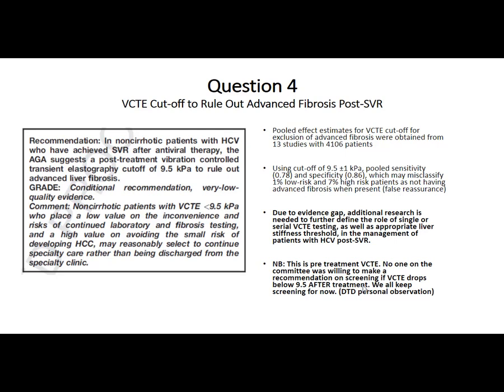No one was actually able to make that recommendation, and all of us would continue to screen for HCC if they ever had a reading above 12.5 or 9.5, actually. Until we know, and it's going to be a long time before we have enough longitudinal data, I think, to be able to figure that out.